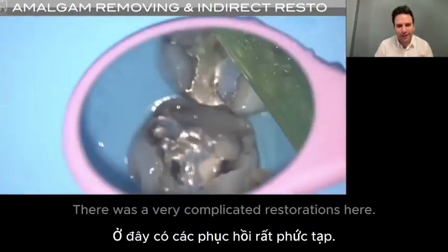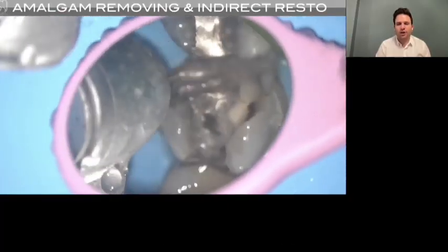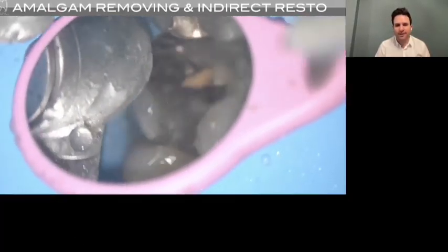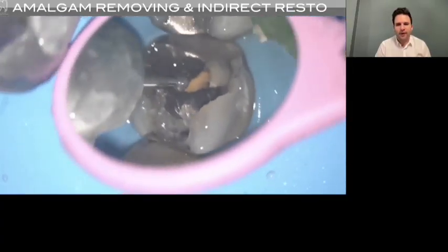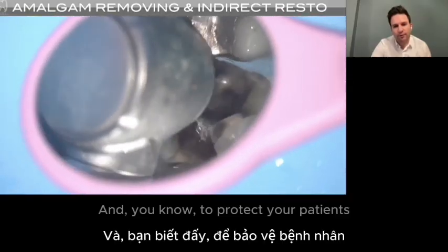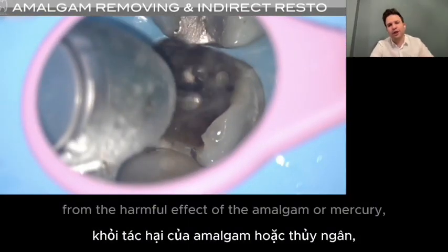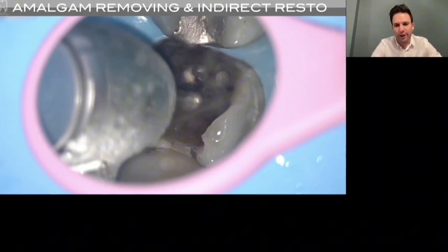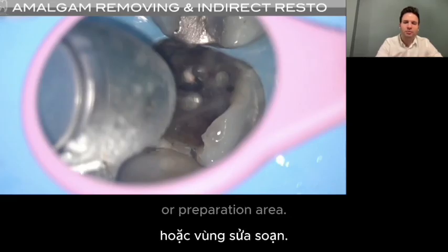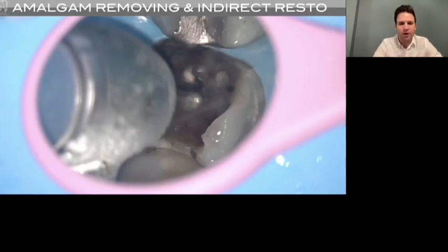There was a very complicated restoration here: a composite restoration with an amalgam underneath the composite. To protect your patients from the harmful effect of the amalgam or mercury, the best way is to isolate the restoration or preparation area under the rubber dam.